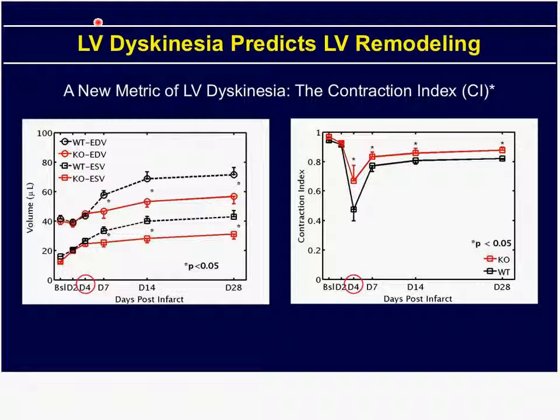So I think that what the question refers to is, can you simplify, or can you expedite your studies by undersampling either in the long axis or in your short axis stack? Is there a minimum number of image planes that you can interrogate and still get essentially the same data?